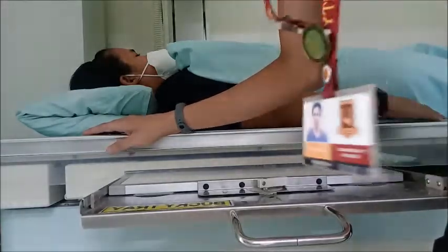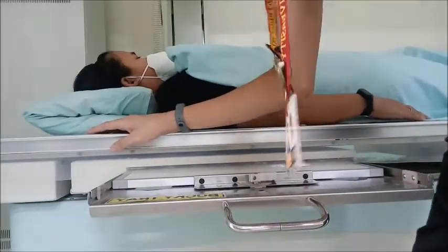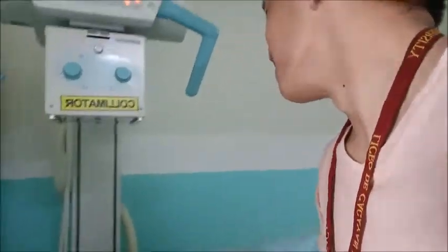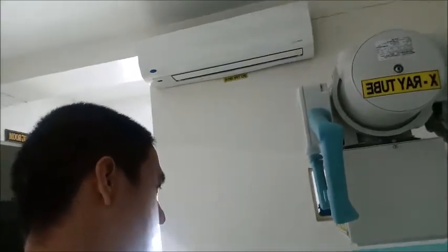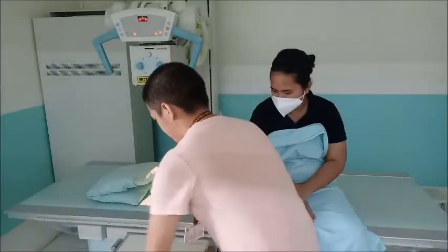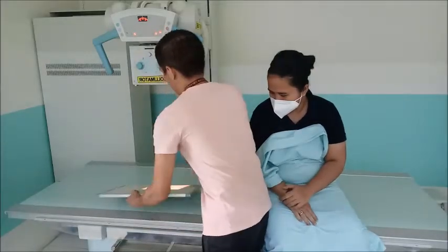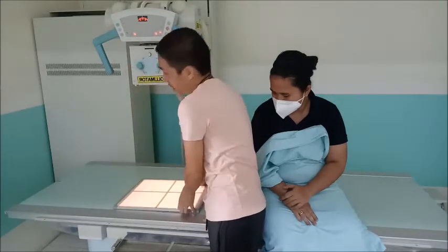Okay, we are dealing with the thoracic cage. Dapat makita si thoracic vertebrae. So dapat si thoracic vertebrae makita po sa niyang silingan adjacent structures. That is C7 sa taas. Nakatulog na itong patient. Oh, ako na-adjust ang collimation ako. Na-adjust ang collimation, yan ang tanawan sa iyo. So, you can decollimate, open tanan. So, open tanan ng collimation.